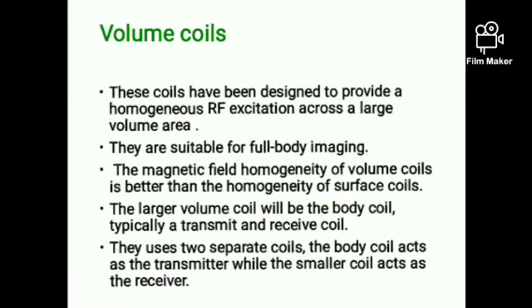So moving towards volume coil, they are designed to produce homogeneous RF excitation across a large volume area, means you can scan a larger part of the area with the help of volume coil, and they are mainly suitable for full body imaging. Okay, next thing is the magnetic field homogeneity. Volume coils are better than the surface coil, as larger area of coverage is there, more information you can get in a short time, whereas larger volume coils will be a type of transmitting as well as receiving signals.